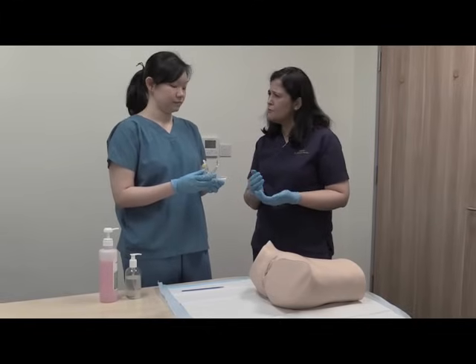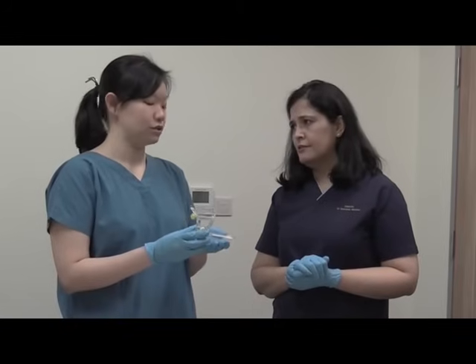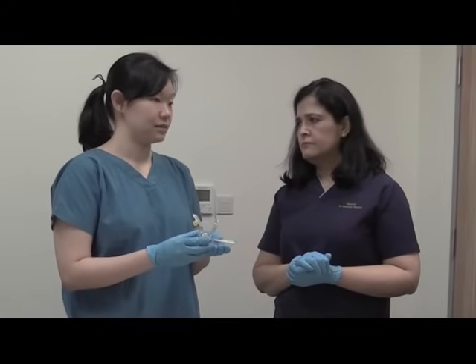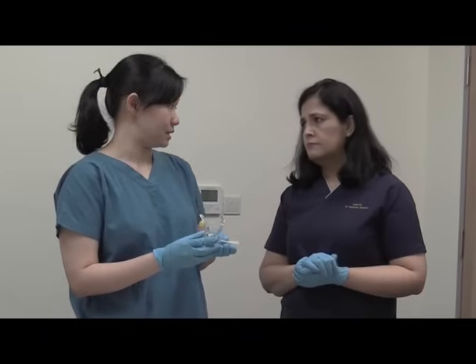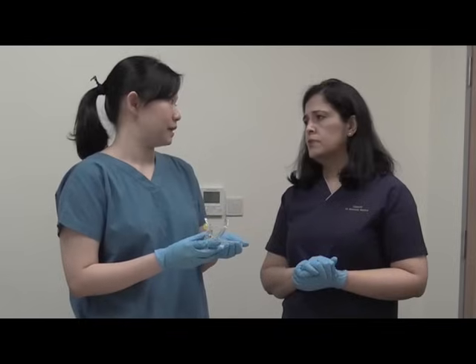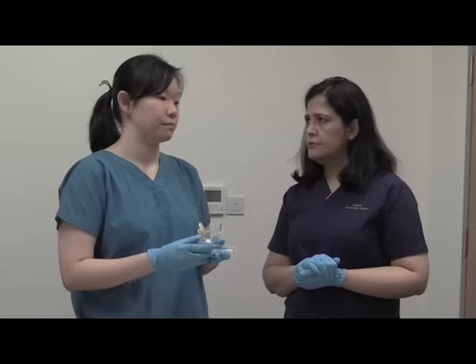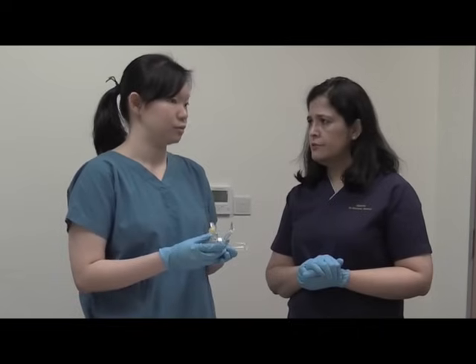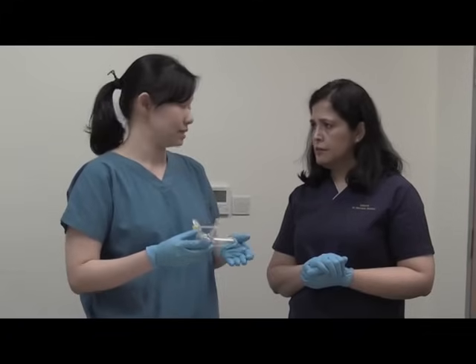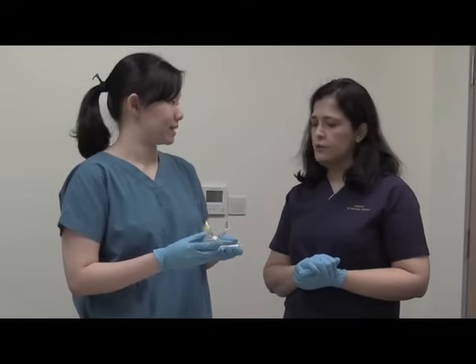So when do we use the pink, the yellow, and the green? For most women we can usually use the yellow medium-sized speculum. However, for post-menopausal ladies or nulliparous patients, they might be more comfortable with the smaller pink speculum. For people who have had multiple vaginal deliveries where the vaginal walls may be lax, or larger-sized ladies, the green speculum may help us more.